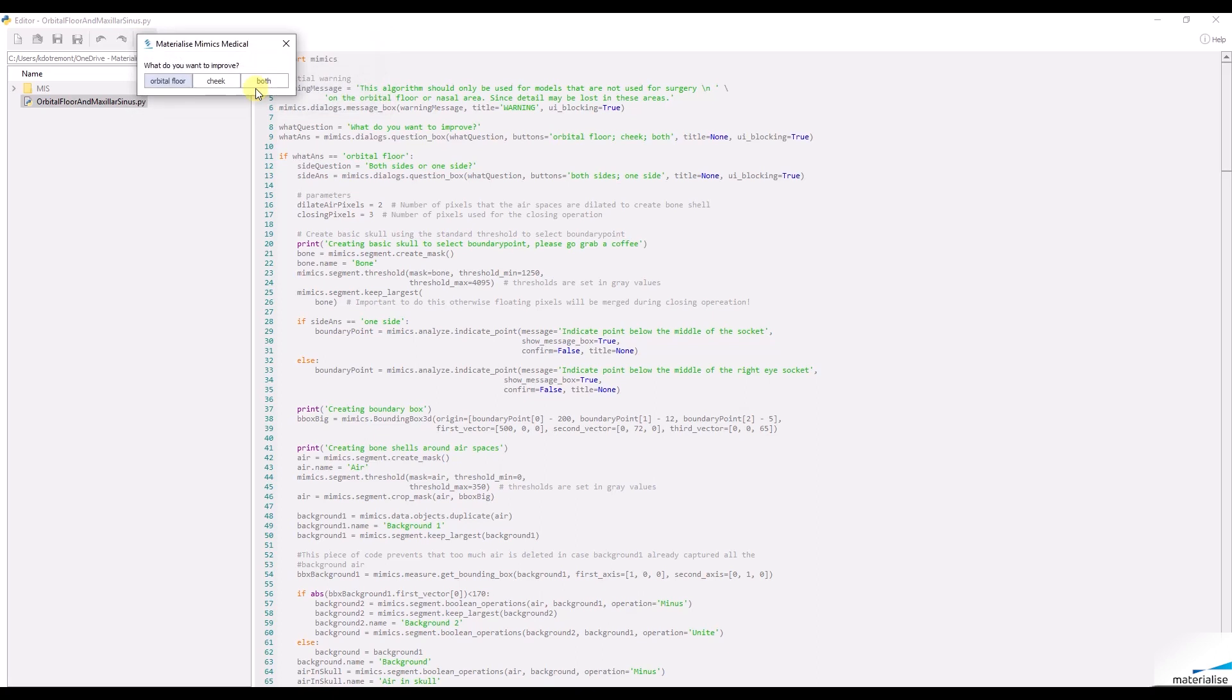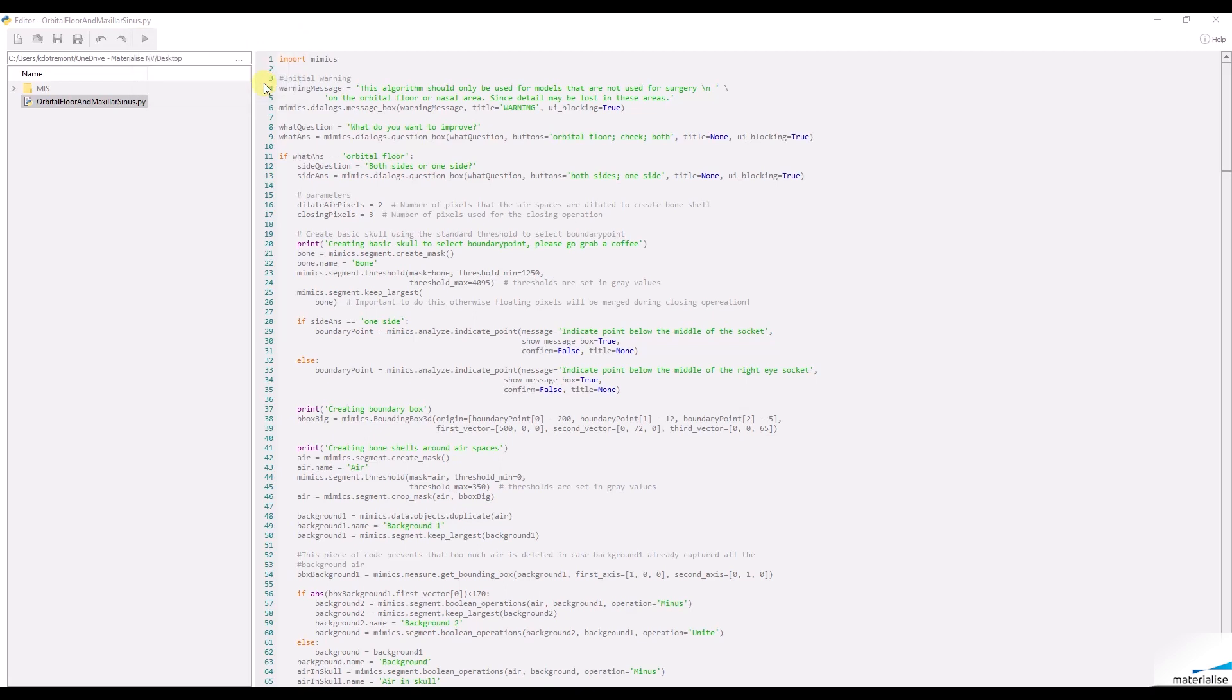The script will automatically segment the skull based on the uploaded CT images. The only thing I need to do is choose what I would like to fill. In this case, I choose to improve both the orbital floor and the maxillary sinus.